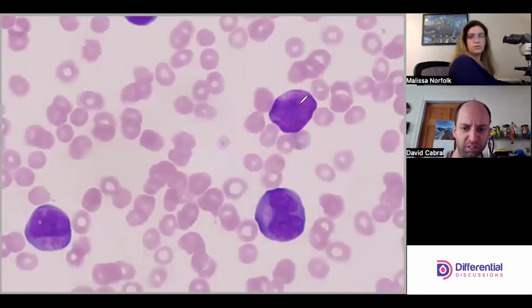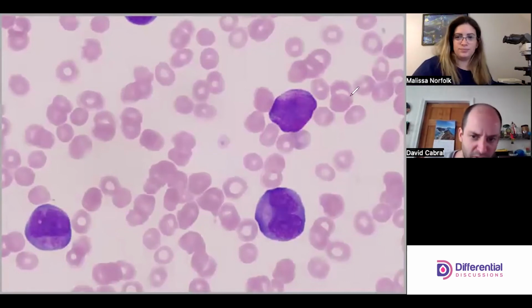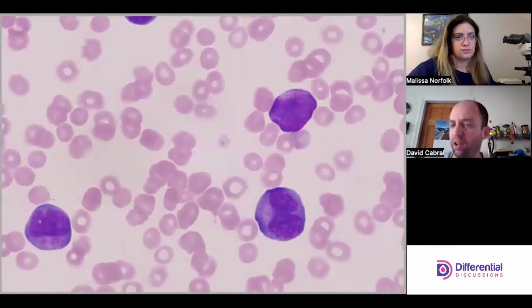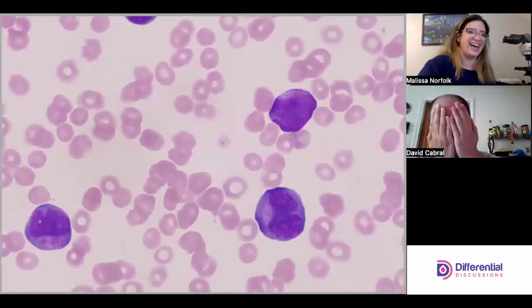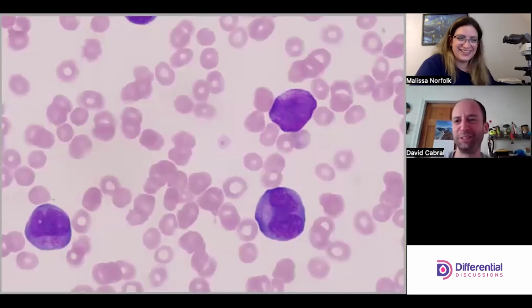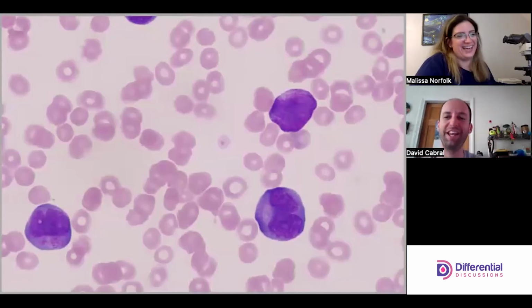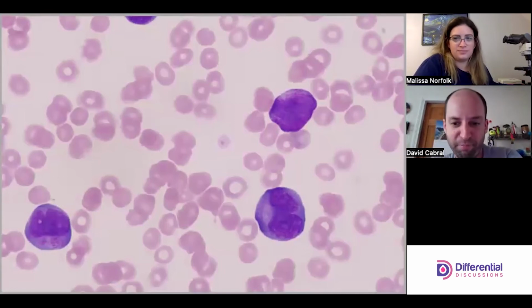Oh, beautiful. We hit the jackpot. These are beautiful, beautiful prolymphs. Yeah. Promyelos. Oh, not prolymphs. There's no prolymphs here. These are promyelos. Oh man. I can picture my students finger wagging at me from me finger wagging at them on terminology. Yep. Sorry. Yes, these are promyelos. But yeah, these are beautiful.